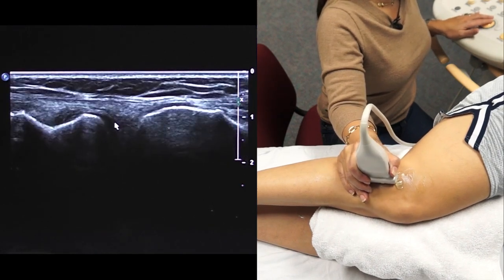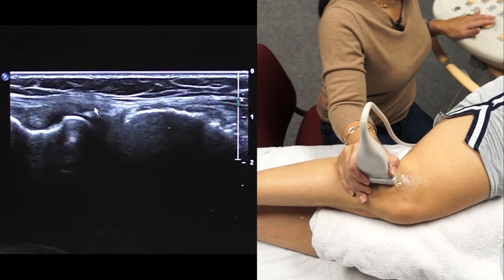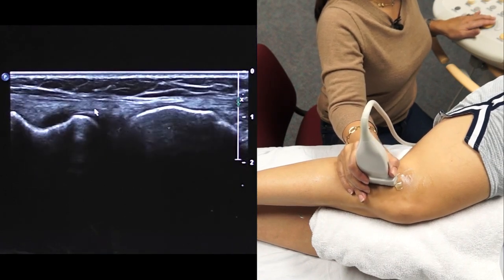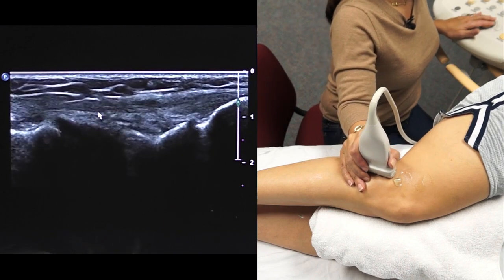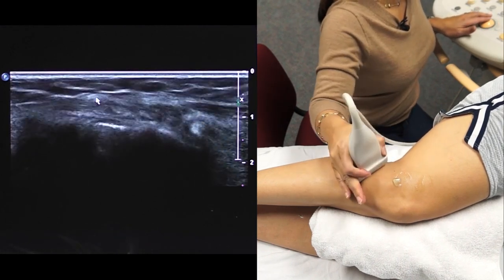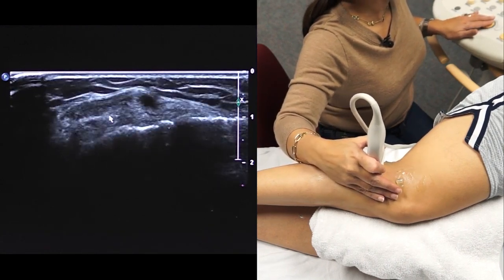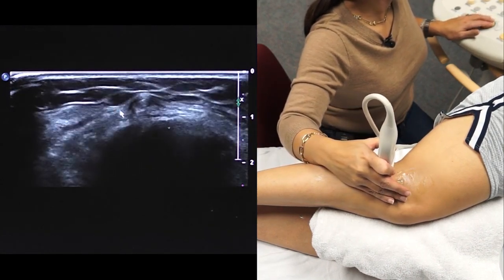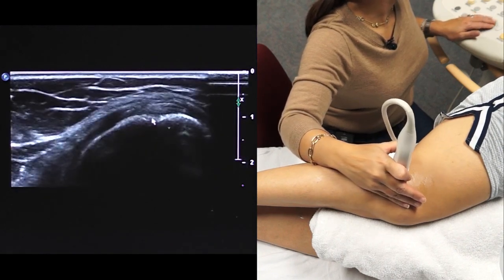Here's a tibia, and the lateral meniscus sits in between as an echogenic structure. And then again, when you're scanning these tendons, you always want to scan in long axis, and then you also want to turn your transducer and look for any enlargement or surrounding fluid or decreased echogenicity in the short axis.